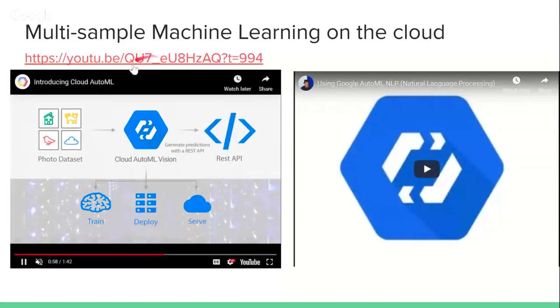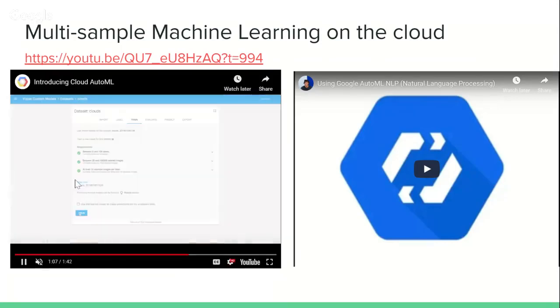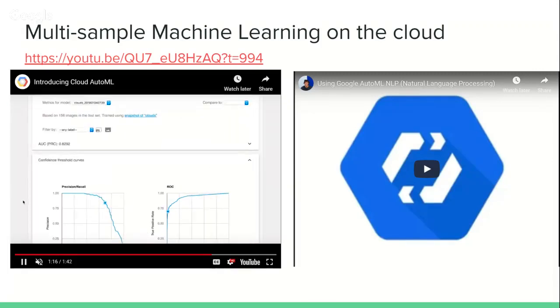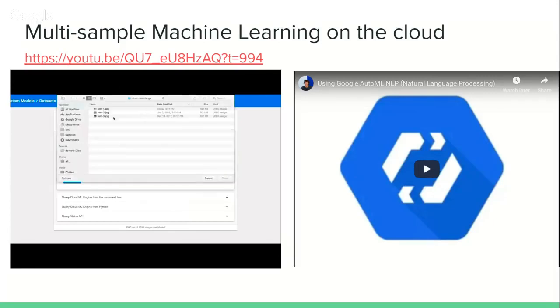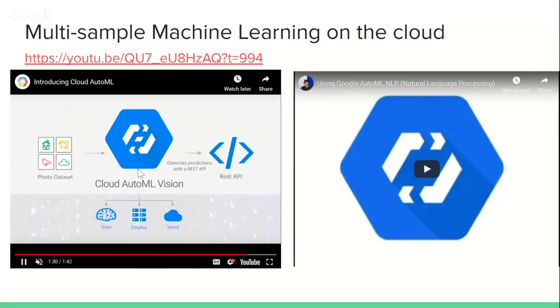And the training is going to train a classifier that we can then have in the Google Cloud system ready to make predictions, right? And so they show here in a graphical way how they build a model, how they click train for these image recognition systems, and they get their ROC curves, and then they can predict based on an input. In this case, the input is an image, but it basically gives you a prediction with a score.